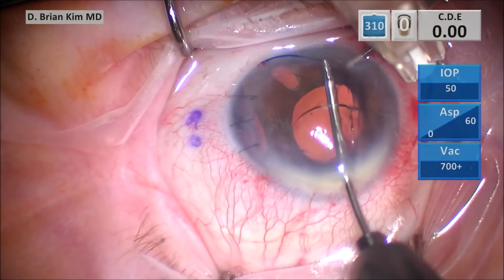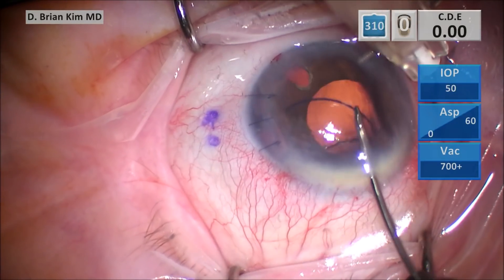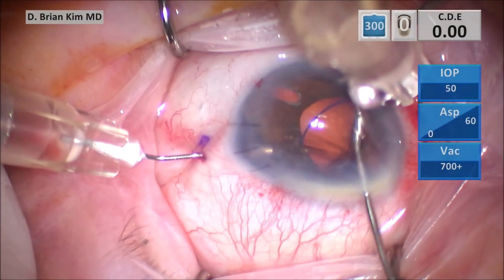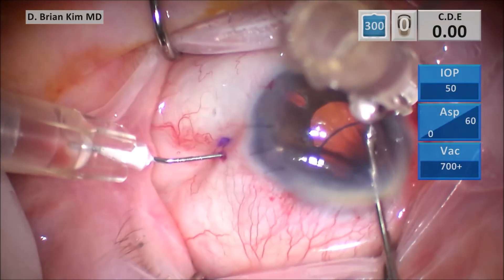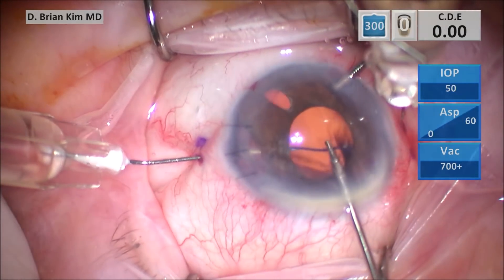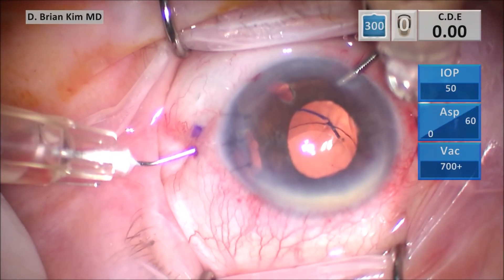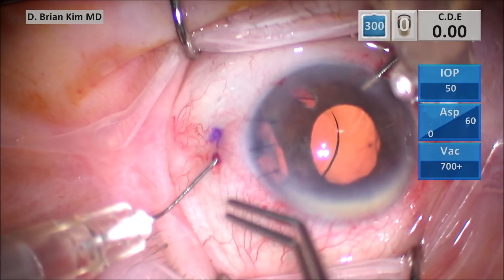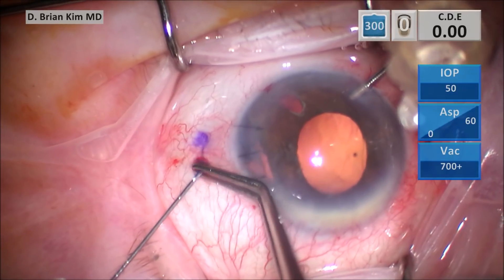Intraocular 23-gauge forceps are then used to grab the leading haptic and pull it into the eye. Forceps are then used to grasp the leading haptic. The needle bevel is facing away and I'm using the curvature of the haptic to dock the needle. Then as I do that, I flatten the haptic and it glides right into the lumen of the needle. The trick is to make sure that the curvature of the haptic faces the approach of the bevel platform.